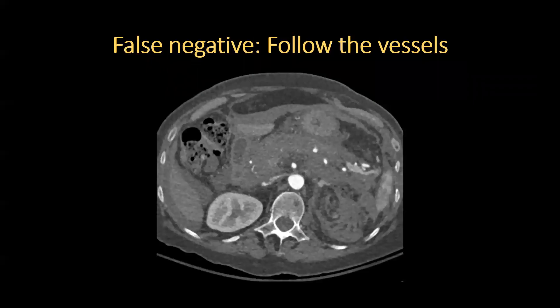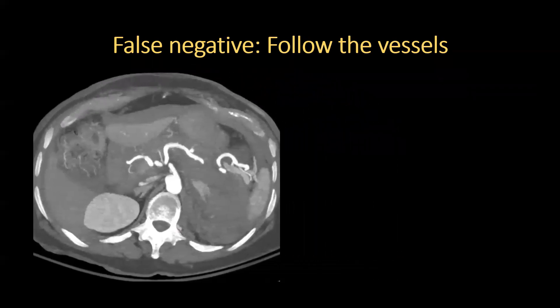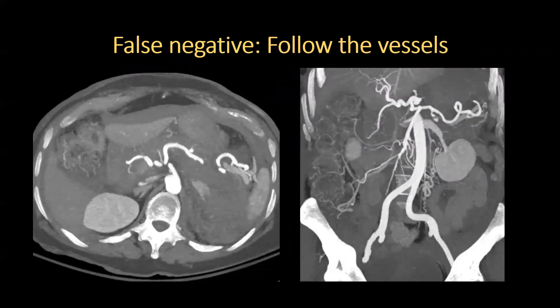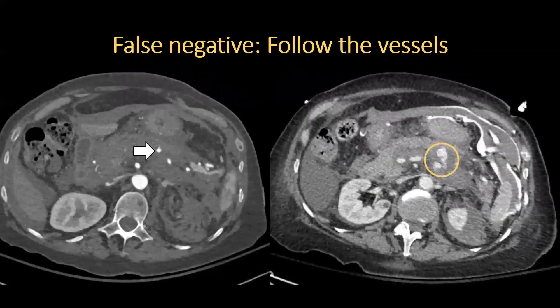This case highlights the importance of following the vessels, including the distal branches. A 67-year-old woman with rheumatoid arthritis presented with severe upper abdominal pain, shortness of breath, and hypotension. Hemoperitoneum is clear on the axial CTA image, but the vessel abnormality is hard to see. On maximum intensity projection, we see focal contrast outpouching along the splenic artery. The coronal MIP CTA image shows a lobulated, saccularly directed contrast outpouching from the splenic artery — a pseudoaneurysm. Two days later it ruptured with massive hemoperitoneum. It's important to follow all vessels, paying special attention to the pancreas where the hemorrhage is centered.